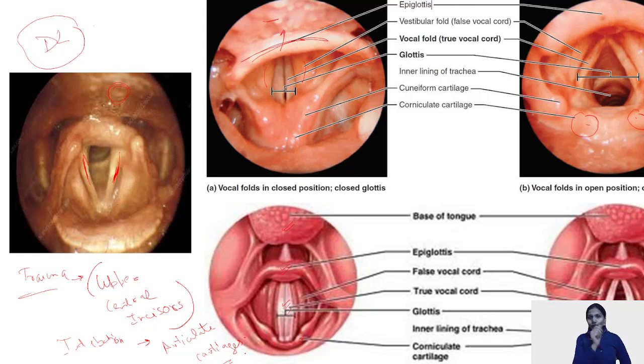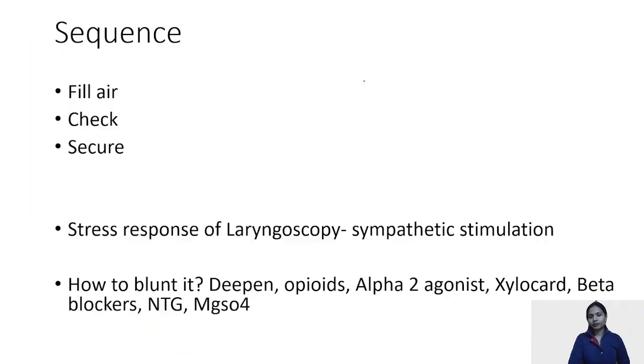That is why it is always told, whenever you're practicing laryngoscopy during your internship days, kindly don't form a lever at your teeth. Your force always has to be towards the ceiling, and don't put in extra force on the teeth. Now, I've told you the glottis is open, you are able to visualize the glottis, and now you're going to introduce your endotracheal tube.